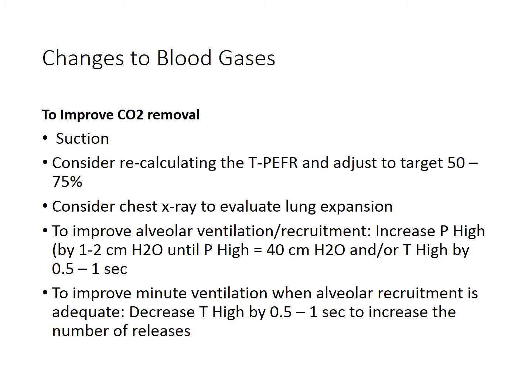Consider getting a chest X-ray. You never know; something could have happened. Pneumothorax can happen. You can have some more volume loss. You may need to adjust your pressures. It's just good to take a look and see what's going on.